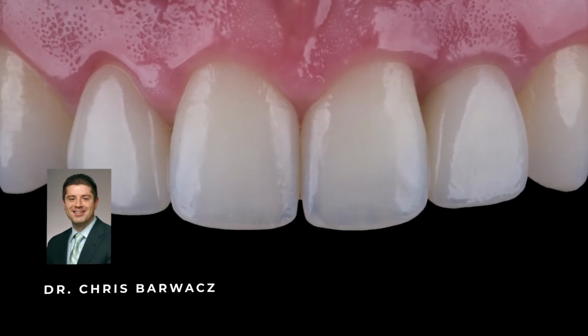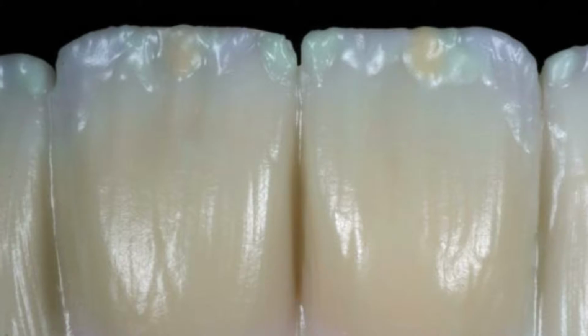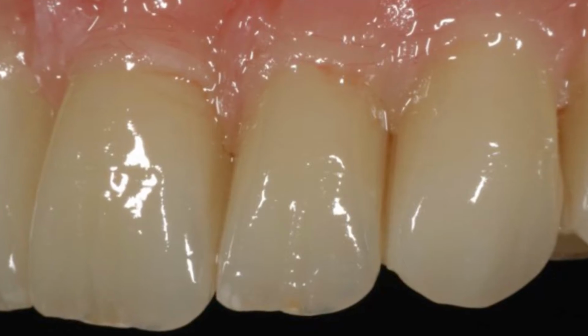In the past, we had no choice but to layer. This was due to the incredible opacity and poor aesthetic results found in early generation zirconia materials. When we had to layer it, it was still important not to compromise the restoration by removing the incisal edge. Early on, I developed special cutback techniques utilized to maximize aesthetics while keeping all functional surfaces in monolithic zirconia. This not only provided great aesthetics, but it also protected the integrity of the restoration.